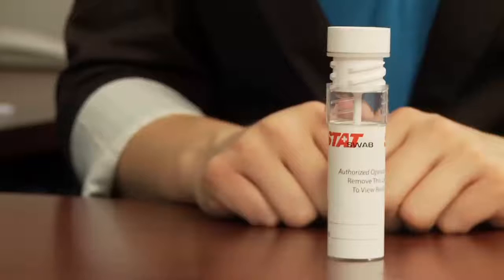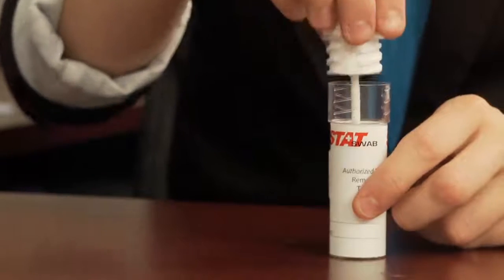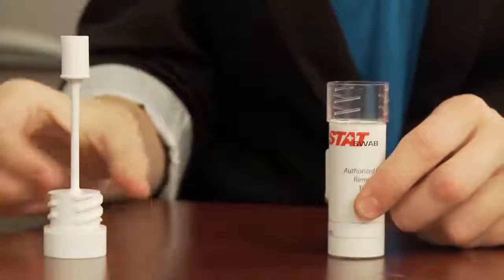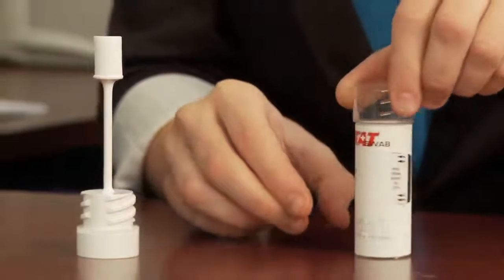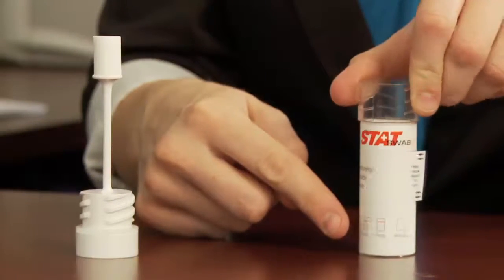Each STATSWAB includes a collector cap and sponge, as well as a collection chamber with built-in test strips. On the label, you will notice a results key for quick reference. The label also has an area for the donor's ID number and the date.